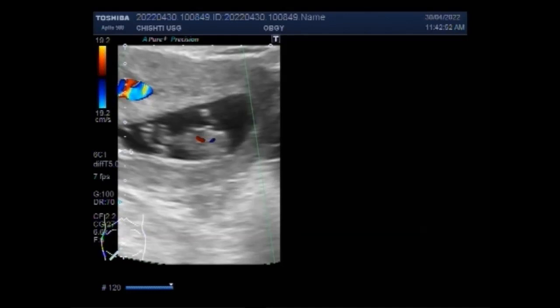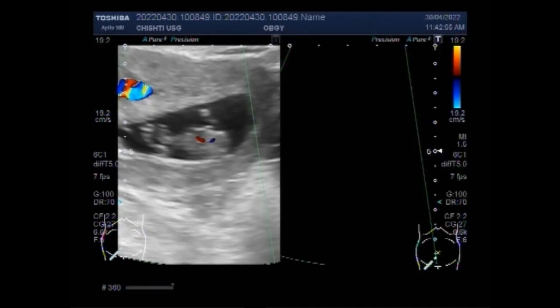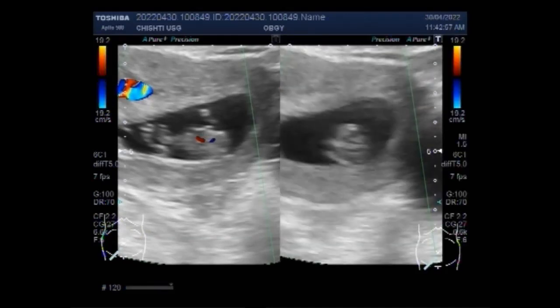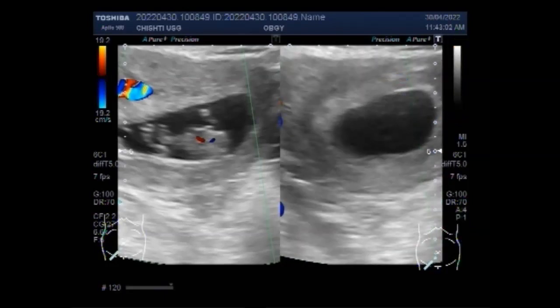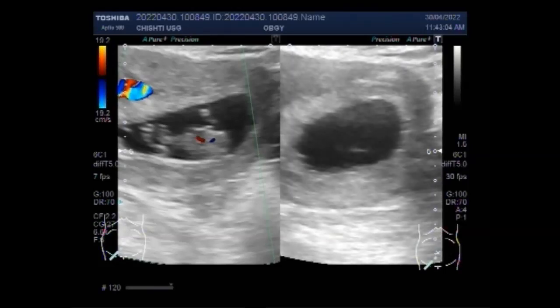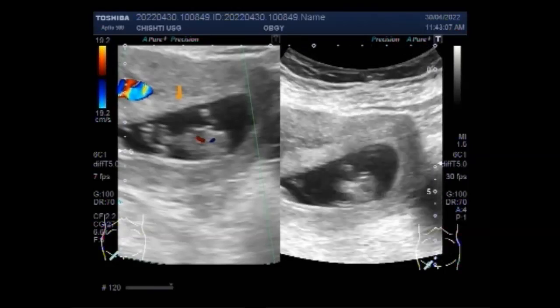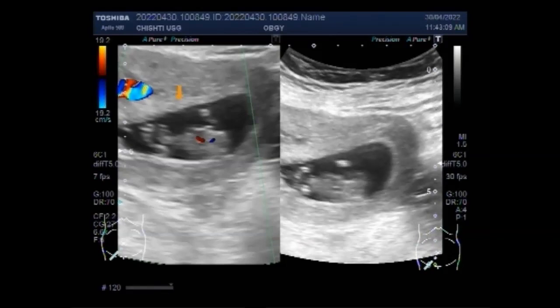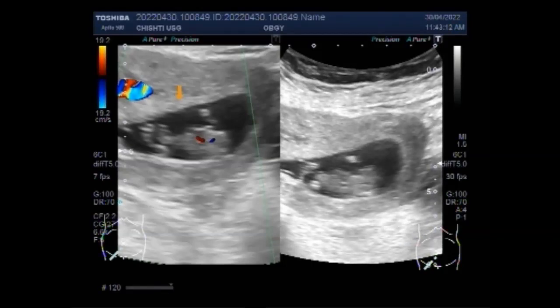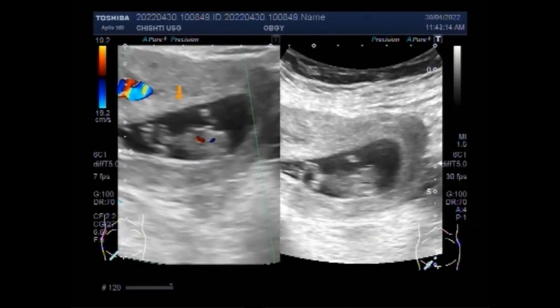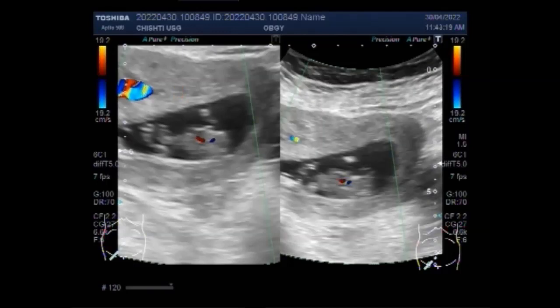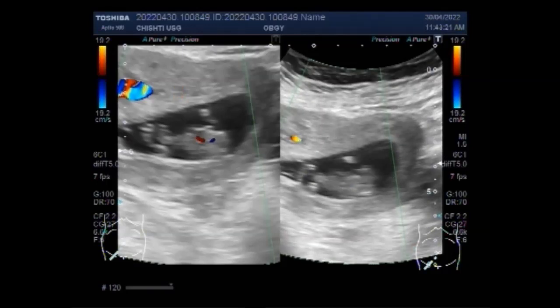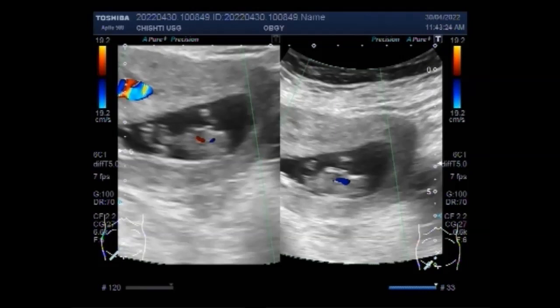Blood flow is again visible inside the fetus. The incidence of ovarian cysts during pregnancy is less than 5% and most of them are benign in nature. Laparoscopic cystectomy proves to be a safe procedure during the first and second trimester of pregnancy.